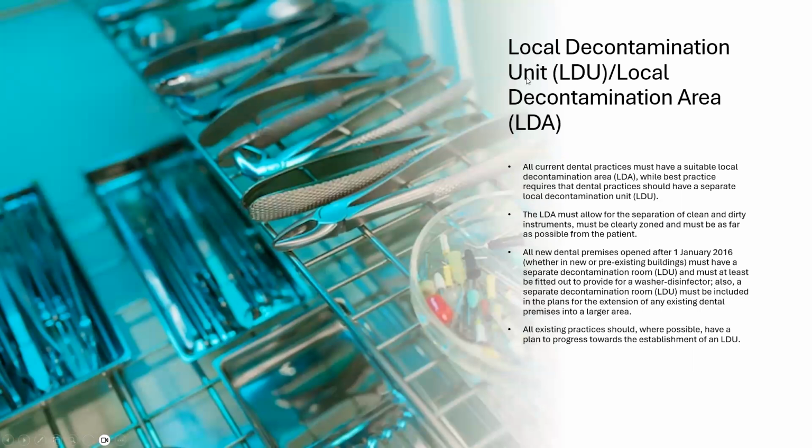Local Decontamination Unit, LDU, or Local Decontamination Area, LDA. All current dental practices must have a suitable local decontamination area, while best practice requires that dental practices should have a separate local decontamination unit. The LDA must allow for the separation of clean and dirty instruments, must be clearly zoned, and must be as far as possible from the patient.